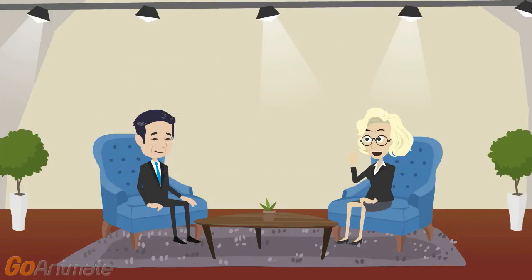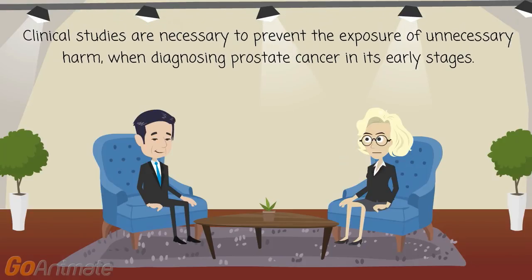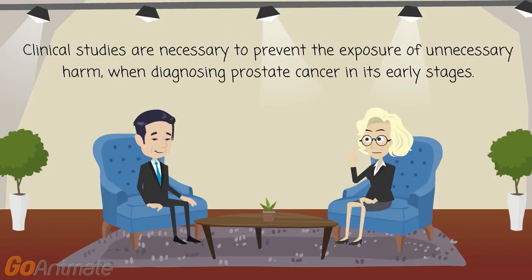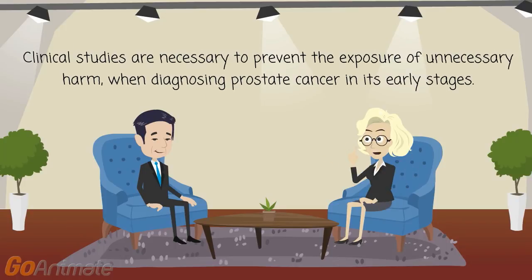Current imaging modalities have excessive significance for clinical application in the detection and diagnosis of prostate cancer. MRI and TRUS are of value in the evaluation of tumor extent and staging of patients. They guide needle biopsies and play an important role in the management of patients. However, additional clinical studies are necessary to prevent the exposure of unnecessary harm when diagnosing prostate cancer in its early stages.